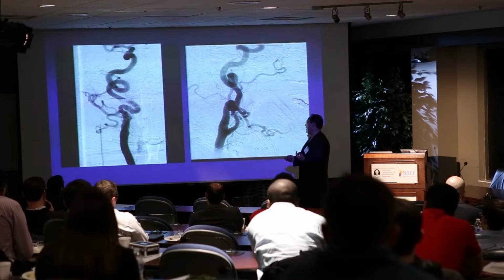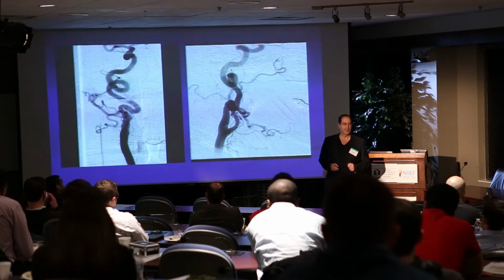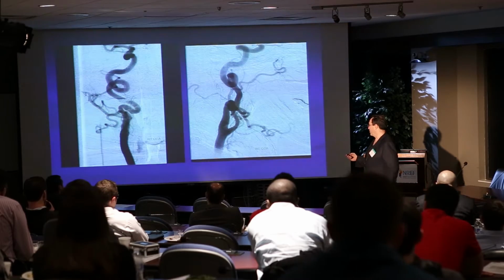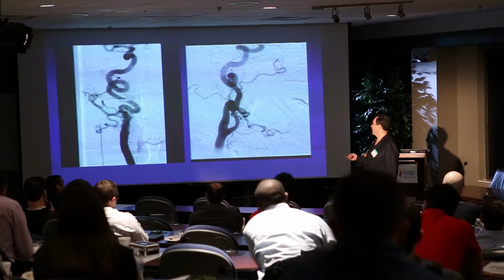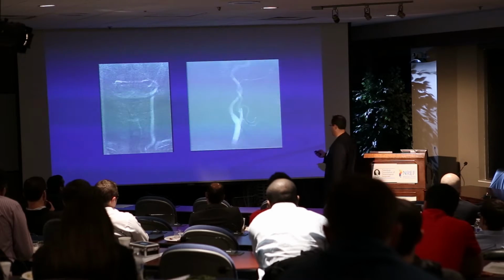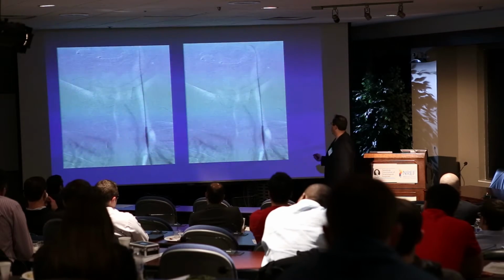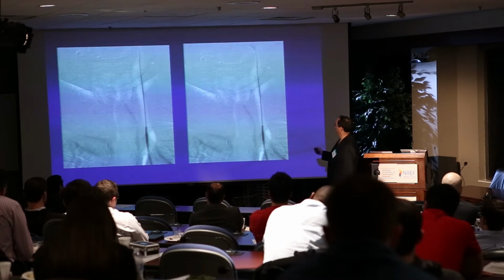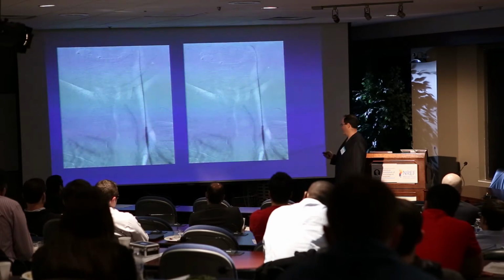And so if you're coming back into a place where either yourself or others have been before, take a look, because there may be things that you might find that will impact your decision making. And again, roadmaps are easy to obtain. Always go ahead with the wire and want to see the tip. Here you don't see the tip, but on this view you do. And then slide over a wire.